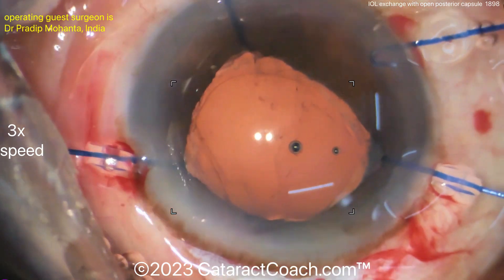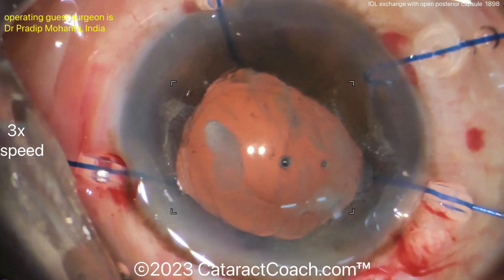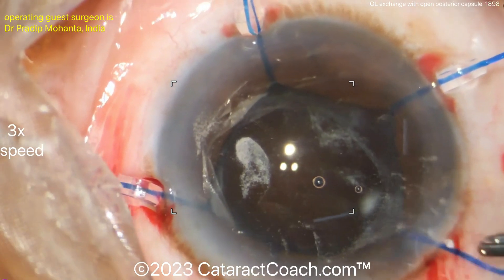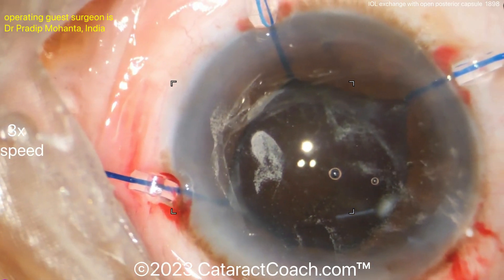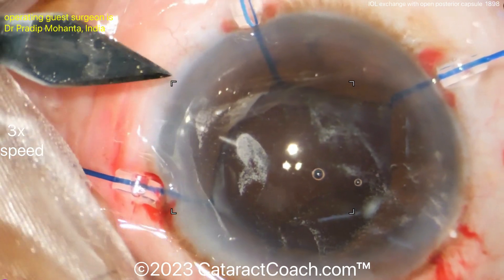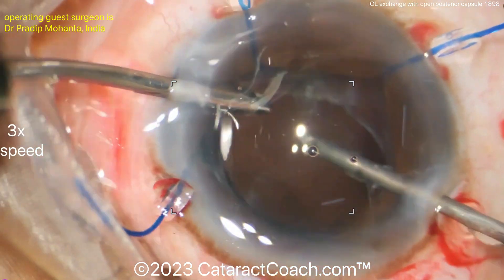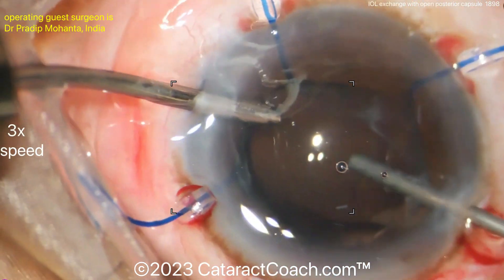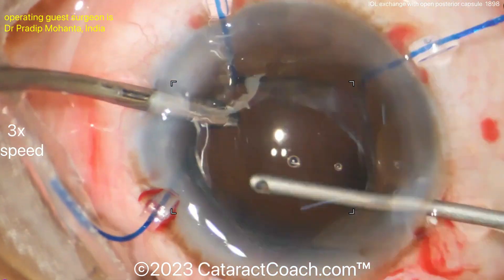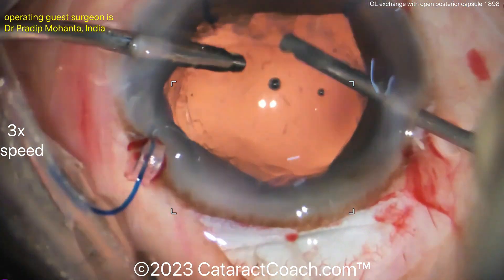There's the triamcinolone — nicely done. A bimanual approach through two smaller incisions is preferred for these anterior vitrectomies so you can visualize how much vitreous is present. The viscoelastic was washed out first because the vitreous won't be stained by triamcinolone if the eye is full of viscoelastic. Two side-port incisions are made for the bimanual anterior vitrectomy.